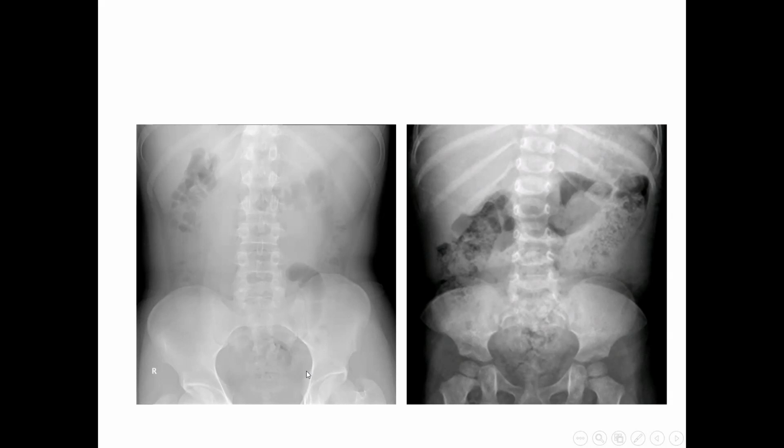Do you see them? You don't see them. Or do you see them? You don't see anything. You don't see the kidney, you don't see the ureter, you don't see the bladder, but you know that they are there. Okay, from the X-rays, you know that these structures are lying there. You don't see them. Why? Because they are soft tissues.